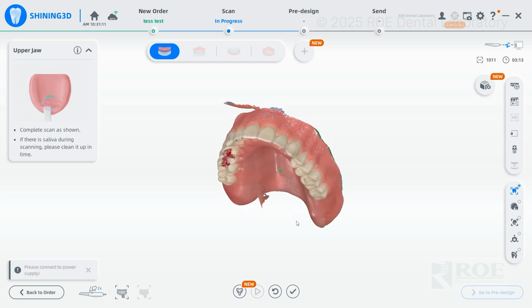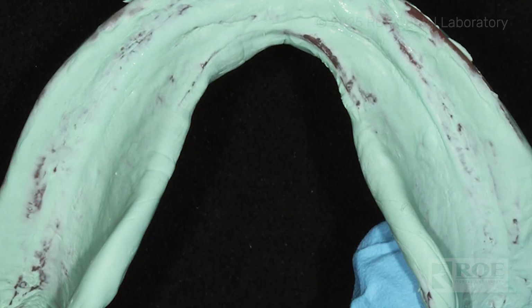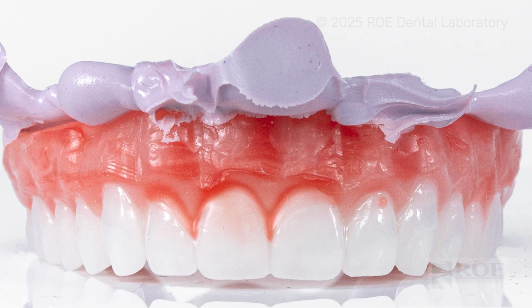Sometimes with certain iOS systems, it can be a little bit tricky to pick up the inner surface of the denture as it's a little bit shinier, as we all know. So what you can do before capturing your 360 scan, if you're having difficulty, is take a wash inside the patient's denture. We like to recommend a blue mousse material, but whatever material of your preference you'd like to use, it can help cover that shiny palatal aspect so that you can take your 360 scans and send it to Row.